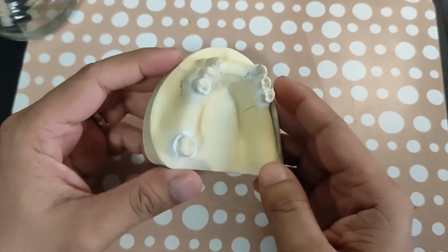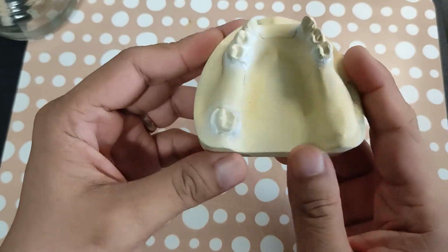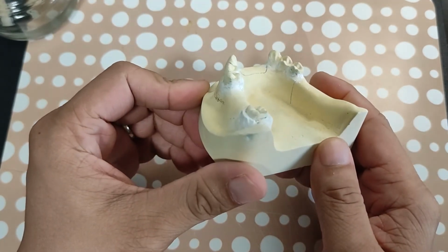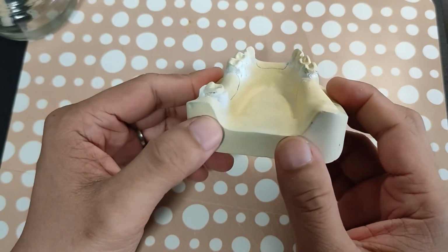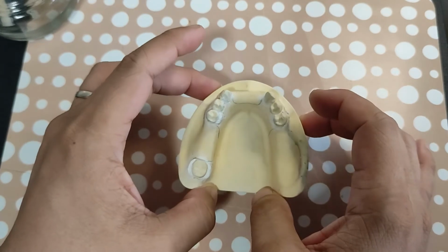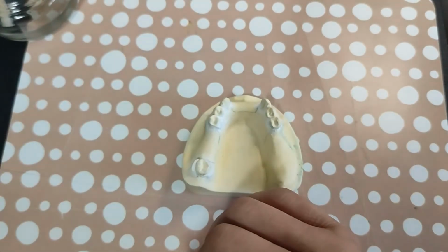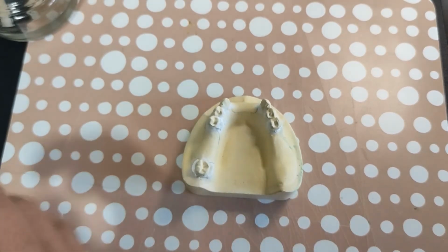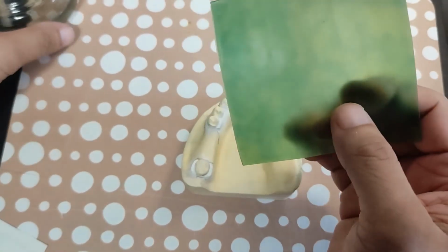Okay, so like I have mentioned, instead of using wax, we used plaster to create the shape and arbitrary blockouts. And now we're going to use sheet wax to create the wax relief. So we get 1 layer of sheet wax first here, and we soften it a bit.